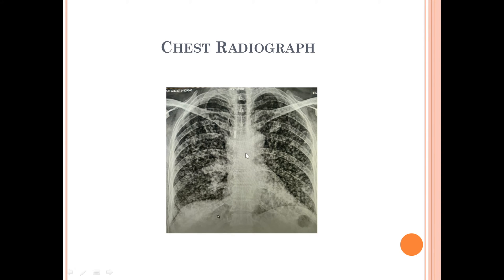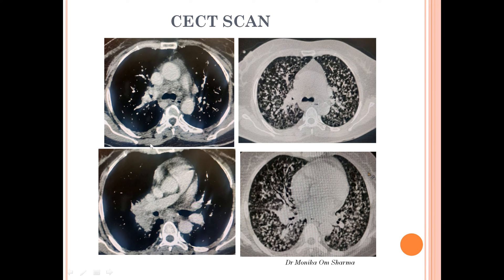First, the chest radiograph was performed. On chest radiograph we can see multiple nodules of size two to three millimeters distributed bilaterally, and there is no lobar predominance. We can also see increased density in the right perihilar region just abutting the right main pulmonary artery. Heart and mediastinum are normal and there is no pleural effusion on this radiograph.